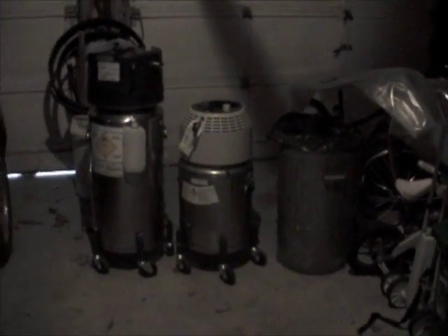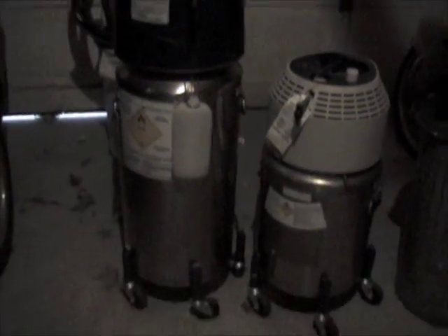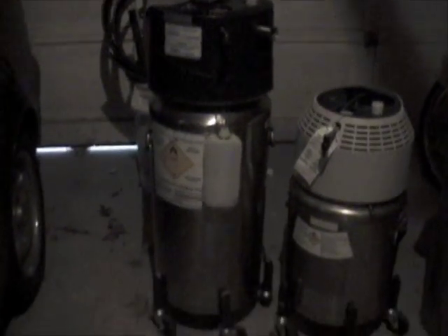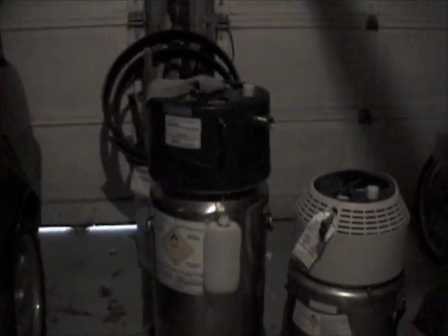These are the liquid oxygen refill units — I just put them in my garage here so you could see them. This one here is the big unit that they gave us the whole time for refilling the liquid oxygen units. That's the one we took camping in the back of our minivan.